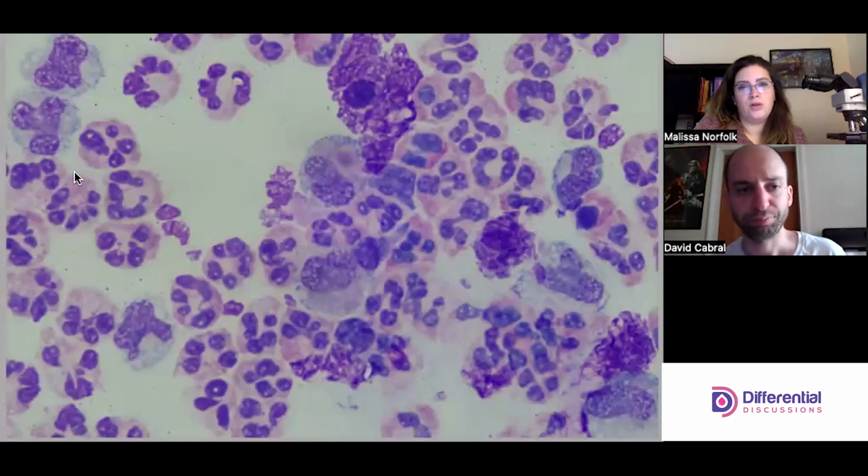So here, all of the orangey looking ones, those are all neutrophils. Then you get to things like this, which is squished. I can't tell what it is, so I'm not going to bother with it. So this is an important factor.